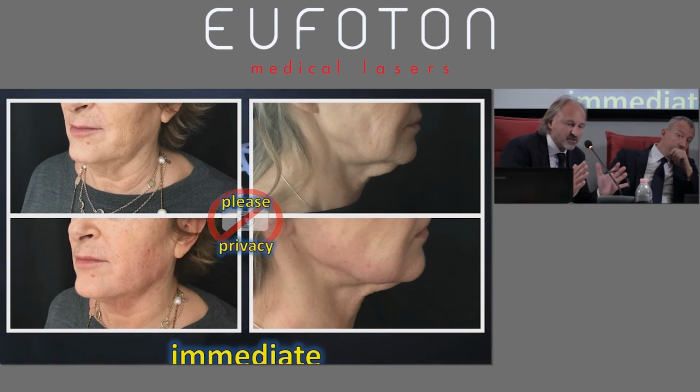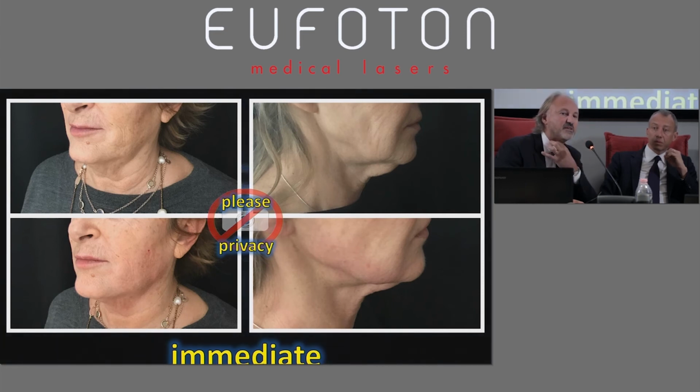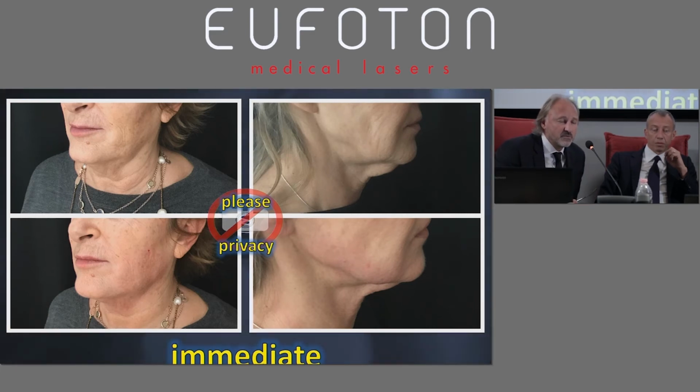We wanted a minimally invasive management without anesthesia. And as we said, lipolysis we do when it's necessary. I do skin tightening in this region, and skin tightening and lipolysis in this area, just changing the parameters.